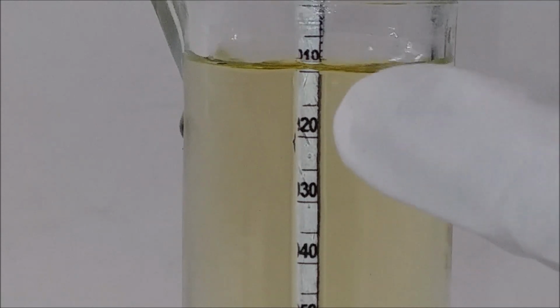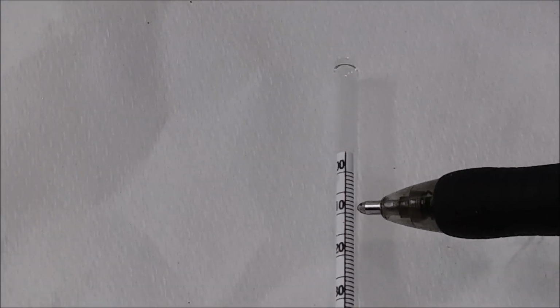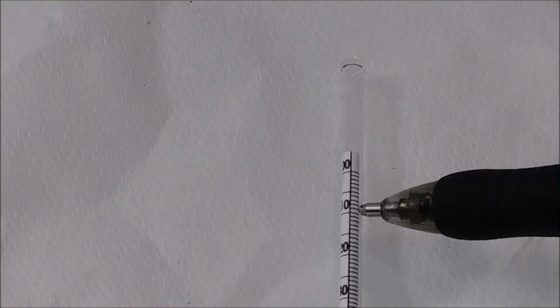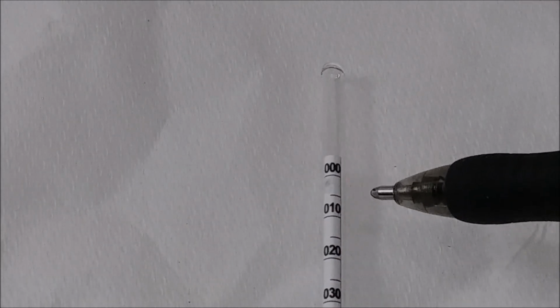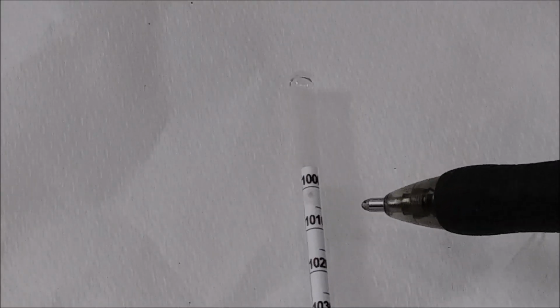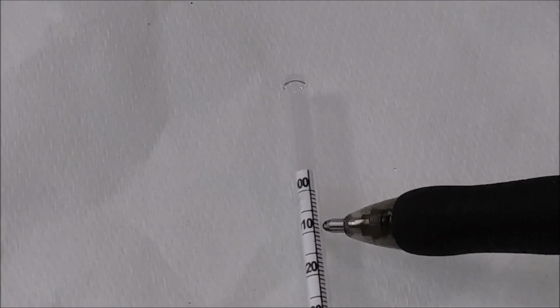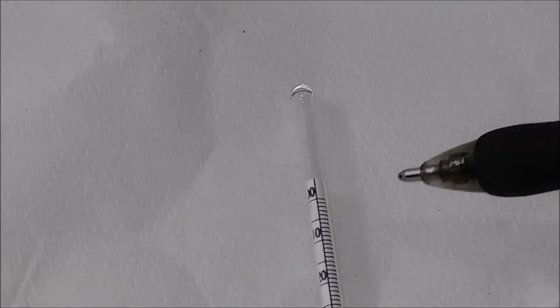Keep in mind when you read the side of the float that there are 3 different size lines: small lines, medium, and large. The large lines are the only ones that have actual numbers associated with them. They're 4-digit numbers beginning with 1000, going to 1010, 1020, 1030, etc. In between the large lines are the medium lines, and they're considered a value of 5. Inside them, the small lines are considered a value of 1. So, how do we calculate specific gravity?